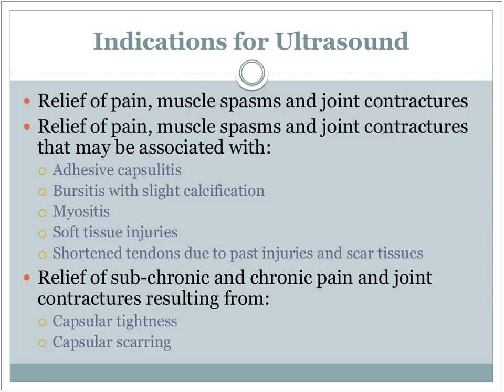Bursitis with slight calcification, because ultrasound can break up some slight calcification. It won't break up a lot of calcification or hard calcification. It'll just reflect the sound waves the same way the bone will, and that can actually cause some irritation or subdermal burning.